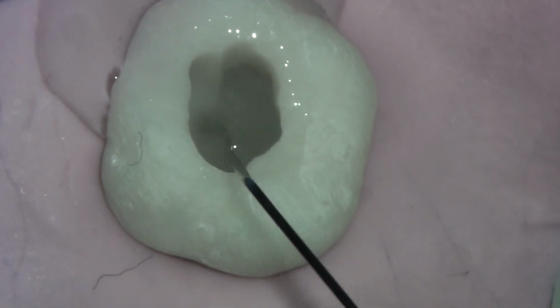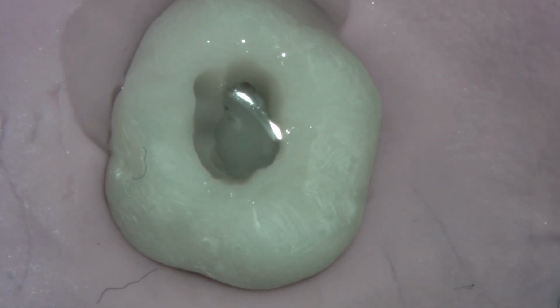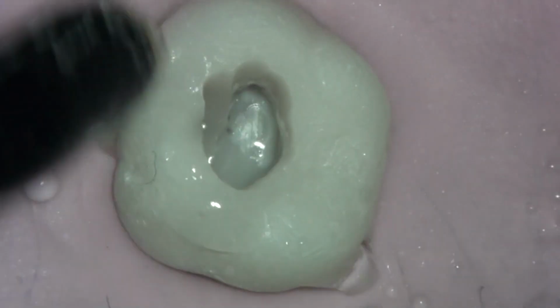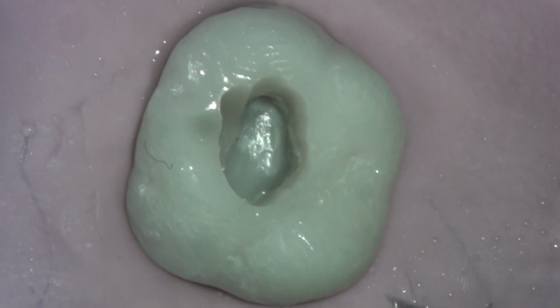And we don't spray air into the cavity, because obviously in a natural tooth we're worried about the problems that may cause. But for the purposes of this exercise, in order for you to be able to visualize it, I will spray a little air just so we can see the floor of the pulp chamber a little bit better. So we get rid of our excess irrigant, and we look back in, and at this point we have got adequate flare, I think, to introduce our first nickel titanium instrument, whatever that may be.